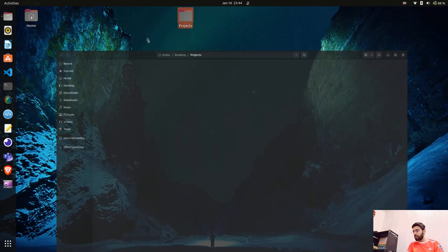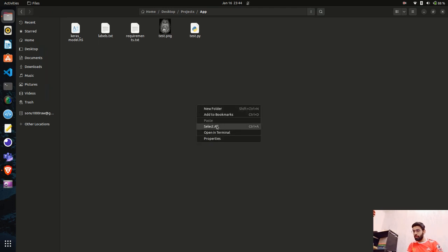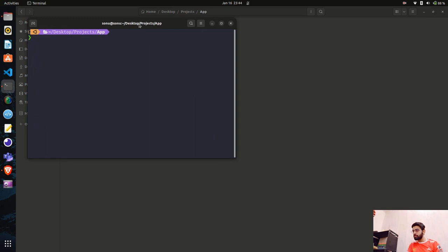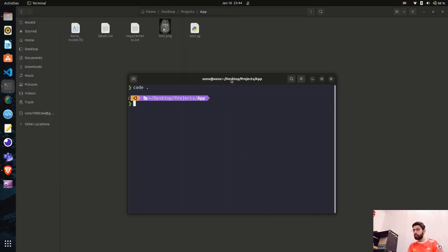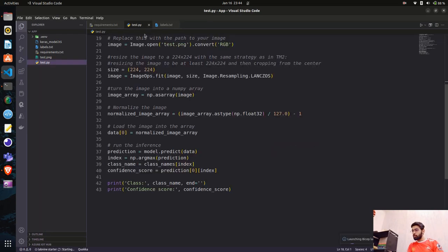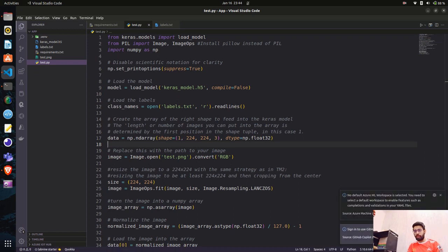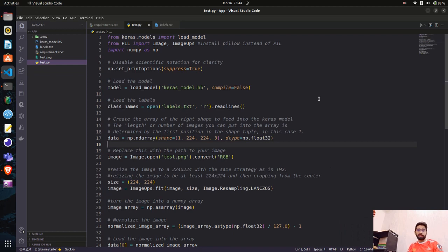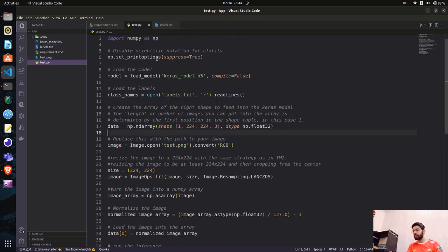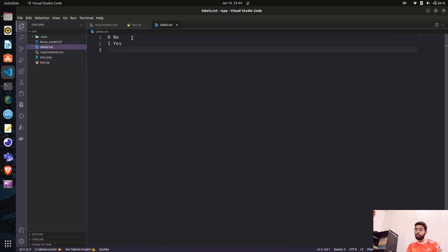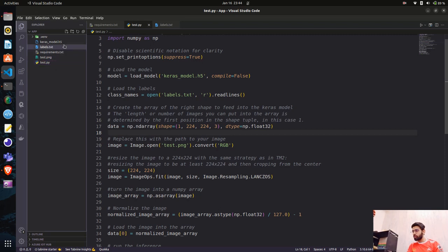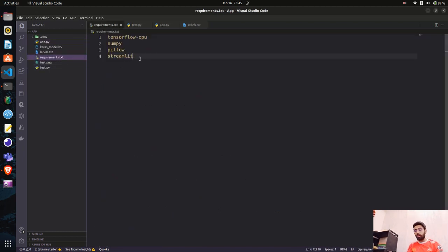Let's go back to our directory, go inside the app folder, and open it in the terminal and VS Code. You can see the test.py file — the code snippet we got from Teachable Machine. We have the keras_model.h5 and labels.txt. In labels.txt, zero is 'no' and one is 'yes' — it's a binary classification model trained on Teachable Machine. We'll create app.py for the Streamlit application. I already have Streamlit installed; add it to requirements.txt if you don't.